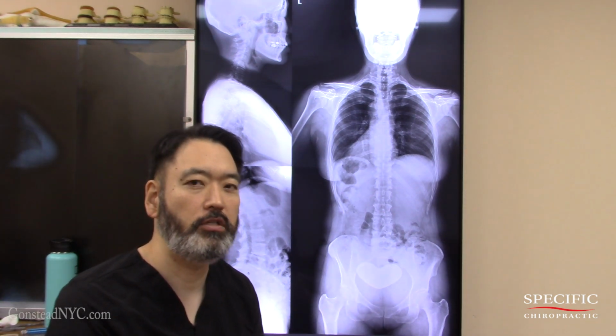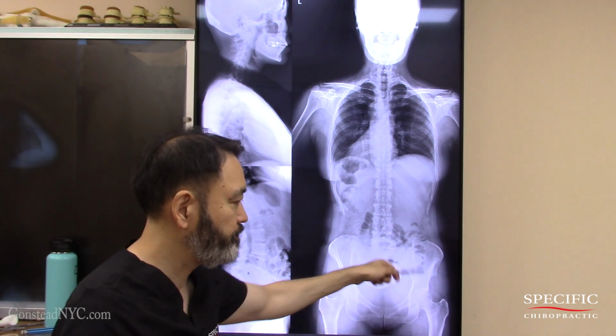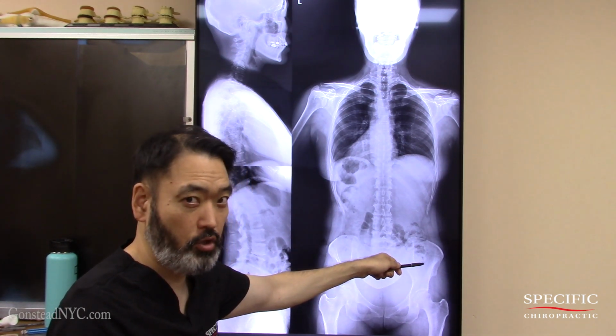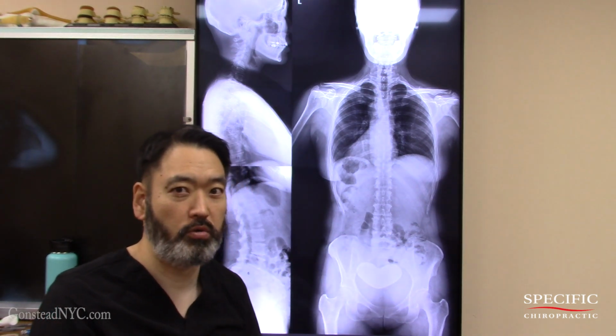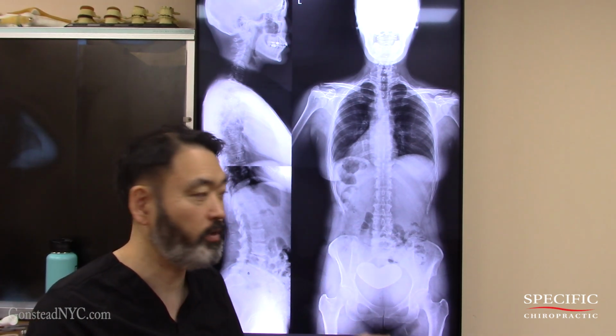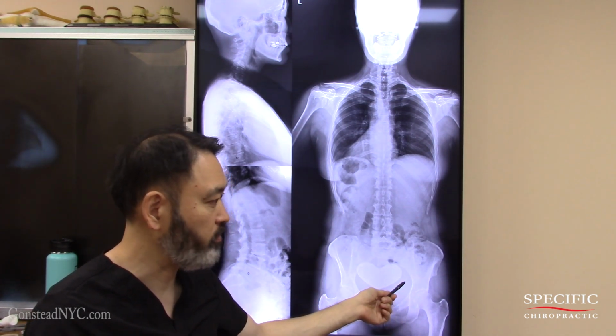Another way is we could also do a tape measure. Measure from here, the AIIS or the ASIS, either one, okay? And go straight down to the foot and see what the distance is. So we confirmed it on her. There is an anatomically short leg on the right side.